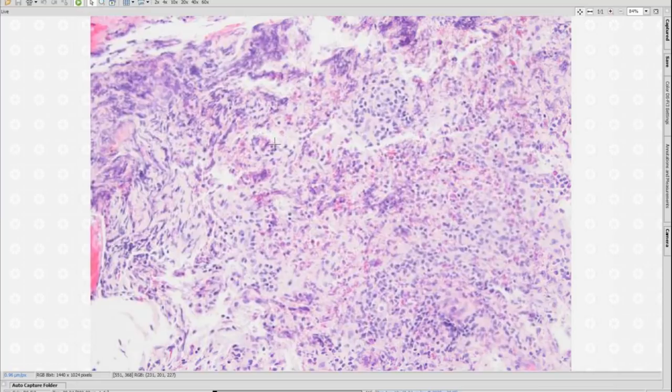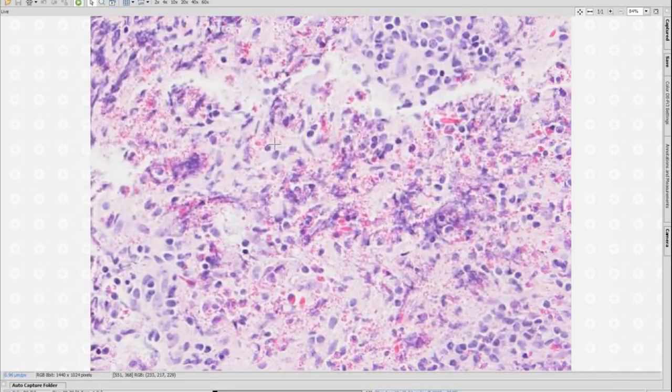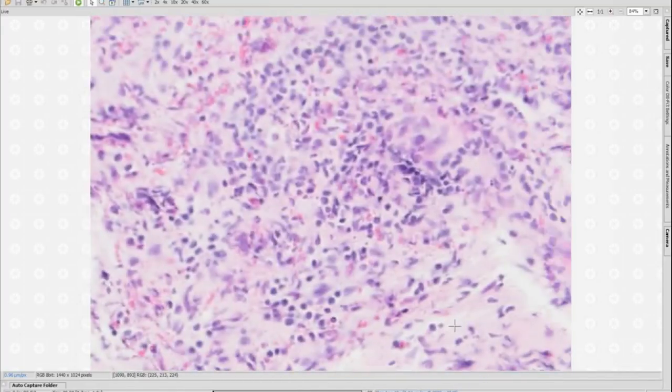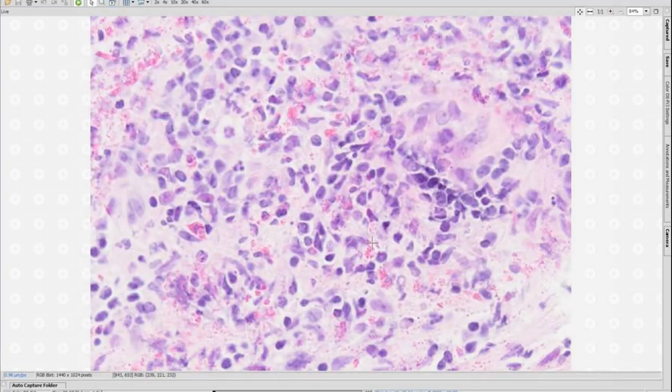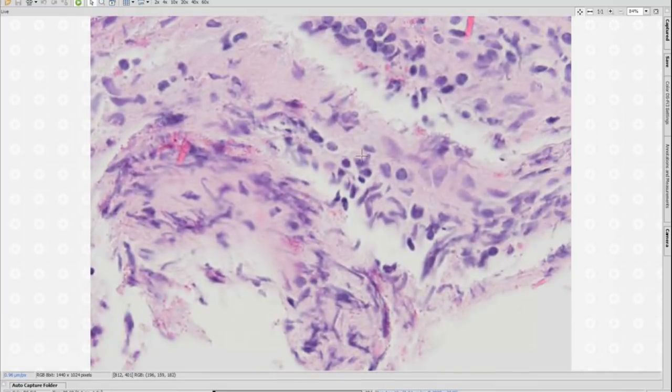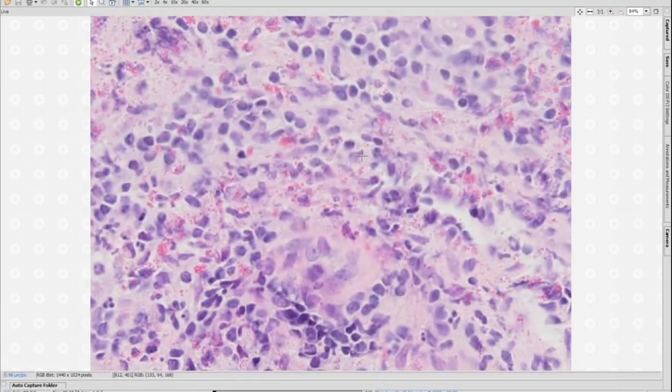This is what you have. So I think this is, it's a large biopsy, but it's fairly representative, right? You have a lot of eosinophils, a few other cells in between. That's where the money is, right? Larger nucleus, slightly histiocytic appearing. Maybe some grooves in the nuclei. So this is Langerhans cell histiocytosis.